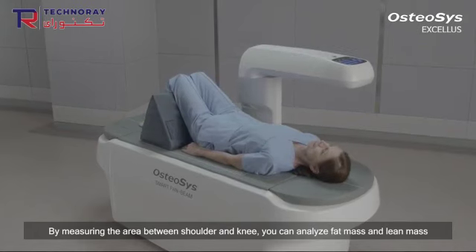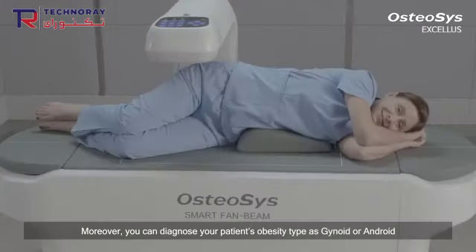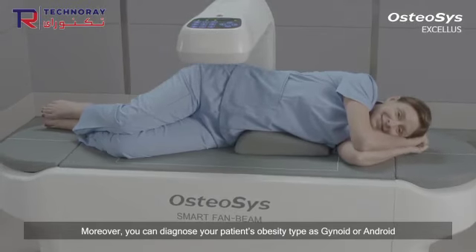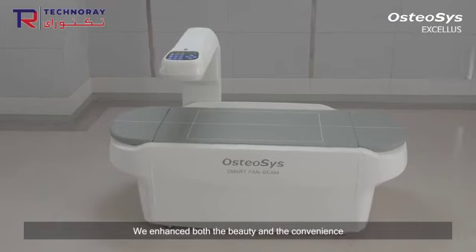By measuring the area between shoulder and knee, you can analyze fat mass and lean mass. Moreover, you can diagnose your patient's obesity type as gynoid or android and manage the patient accordingly.